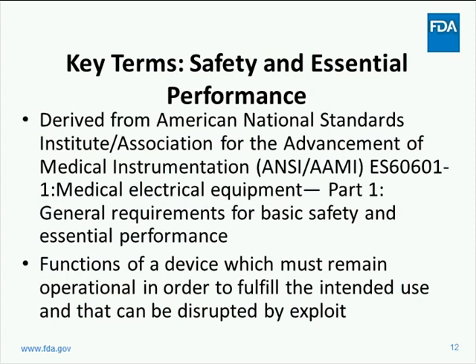The utility of the term safety is to key medical device manufacturers in on the functionality of a device which must remain authentic, integral, and available for a device's safe and effective operation and delivery of the intended use. To further clarify with respect to existing FDA-recognized standard definitions, and particularly IEC's use of the term basic safety, FDA views basic safety as a subset of the FDA's definition of safety.